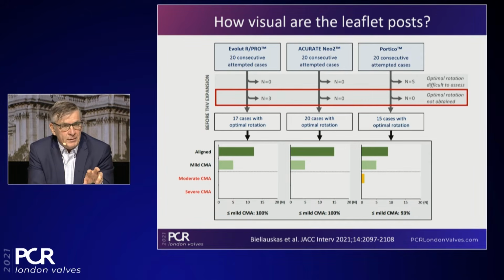So again, two main factors to do it. It should be easy to identify the leaflet post, and it should be easy to torque the system.